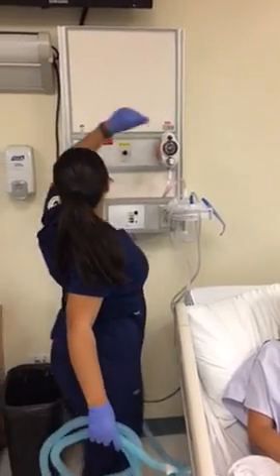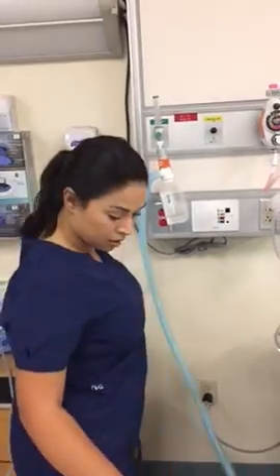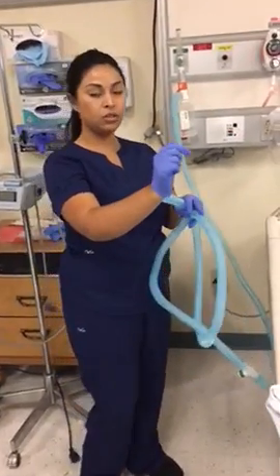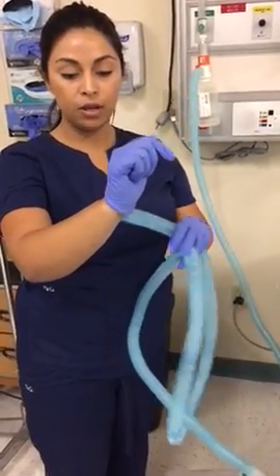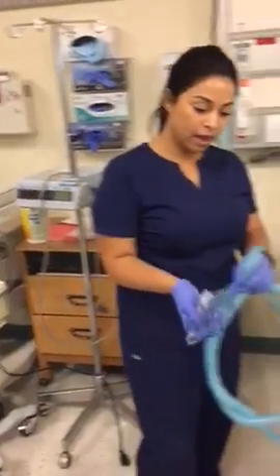So I can turn on my oxygen source. I want it to be at 5 liters a minute, again because that's the physician's order. And I want to check to see if there's adequate humidity coming out. I can just hold it against my skin and feel that humidity coming out before I put it on the patient. Now that I've confirmed there's adequate humidity, I can attach it to the mask.